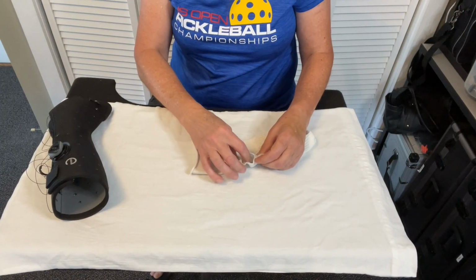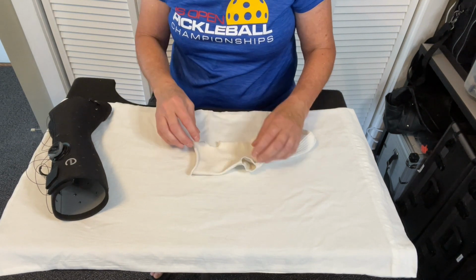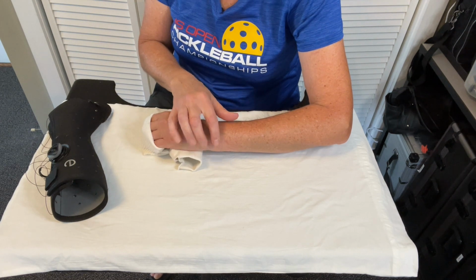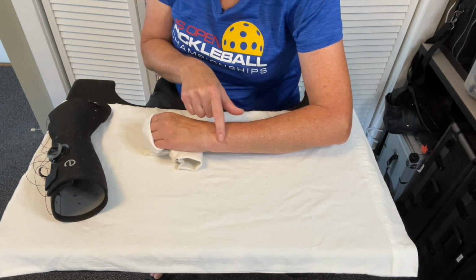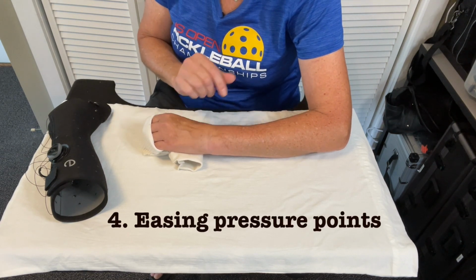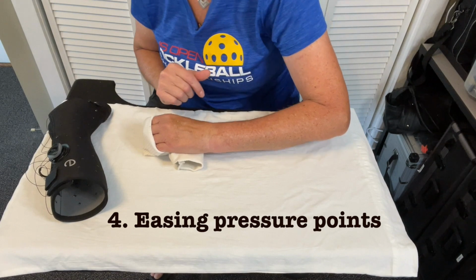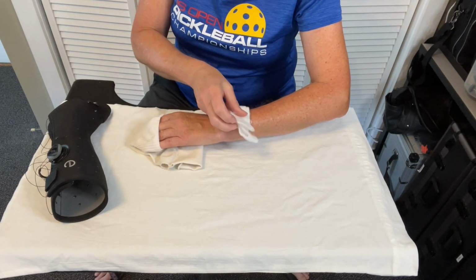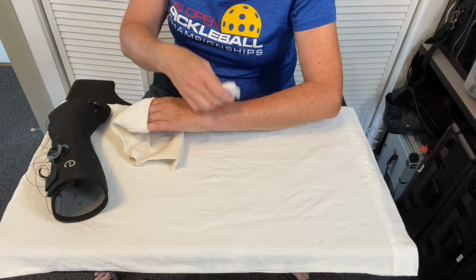And there's a heel here, but that heel happened to line up with this bone on my wrist, which I got a little chip in as well. And so any pressure on that is a little uncomfortable right now. So what that little hole does is I can slide in a piece of padding, some cotton padding such as this, to just add a little extra comfort under there.